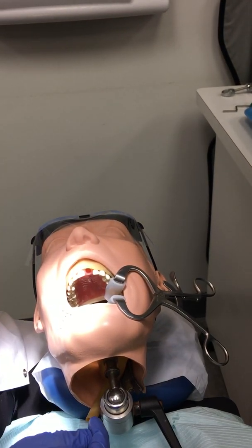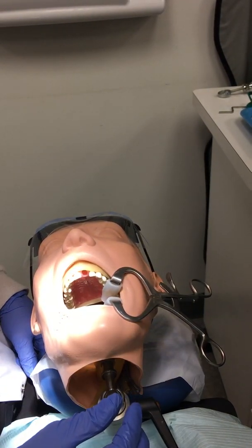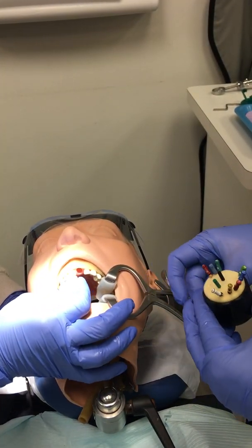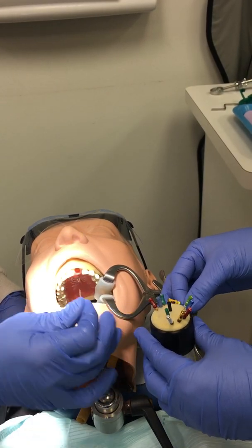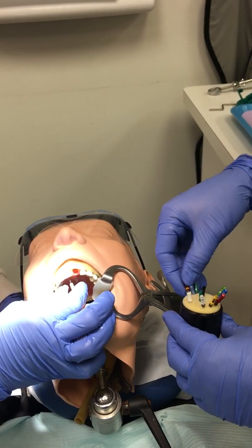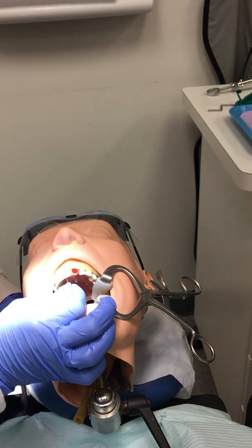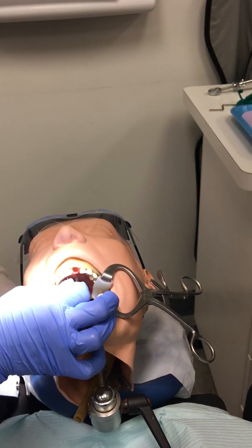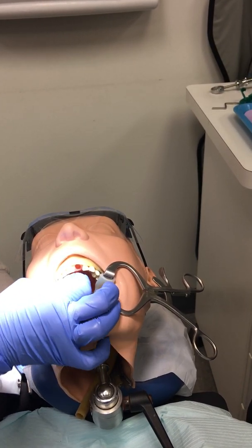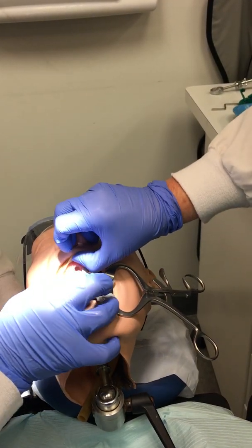Now it's time for the K files. Either you will have these in a ring device for your doctor to use, or you will pass the one he requests. These are normally identified by number. At this time, the doctor can also use the apex finder to ensure the file is 1–3mm from the apex. Upon the doctor's cue, a PA needs to be taken to check and record the working lengths with the K file still in the canal.